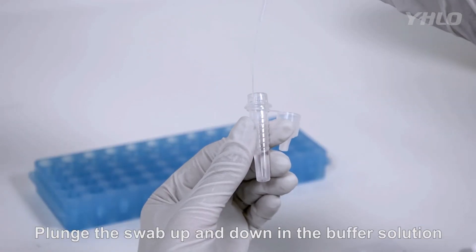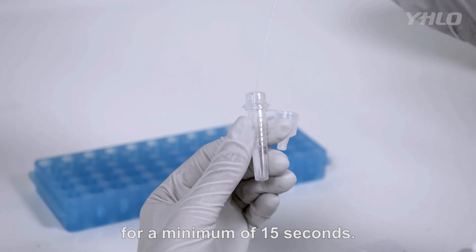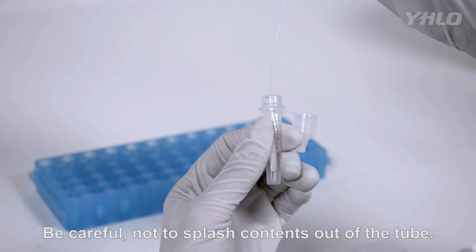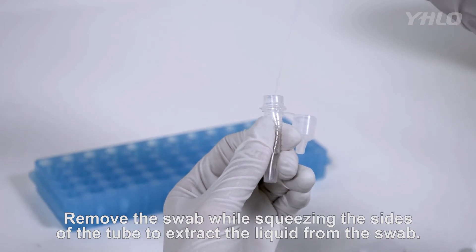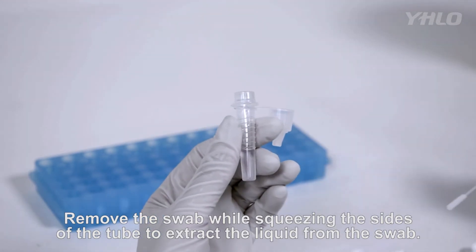Plunge the swab up and down into the buffer solution for a minimum of 15 seconds. Be careful not to splash contents out of the tube. Remove the swab while squeezing the sides of the tube to extract the liquid from the swab.